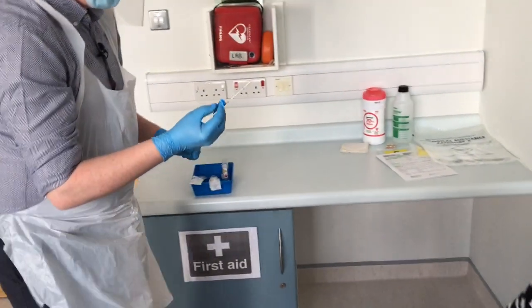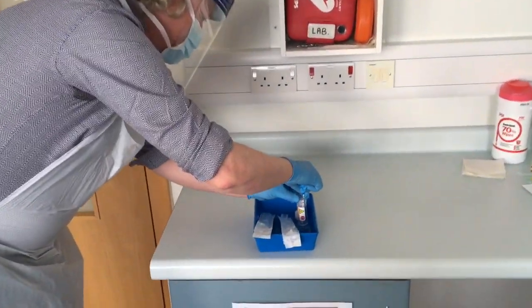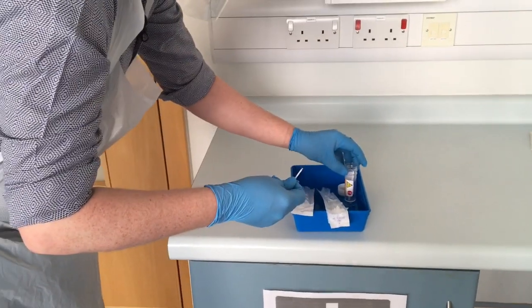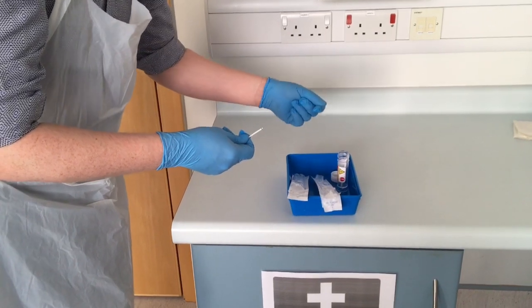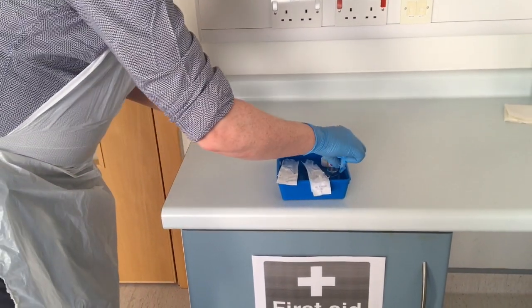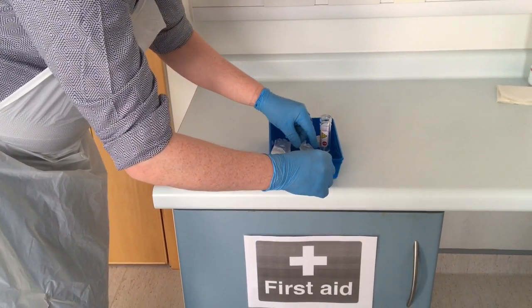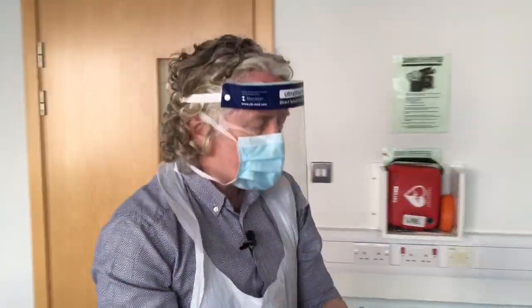Having taken my throat swab, I'm going to break it off inside the sample bottle. Some of these swabs you might need to use scissors just to clip it off; many of them have little break points so it's easy to break them into the universal container. Next, I'm going to take the nose swab.